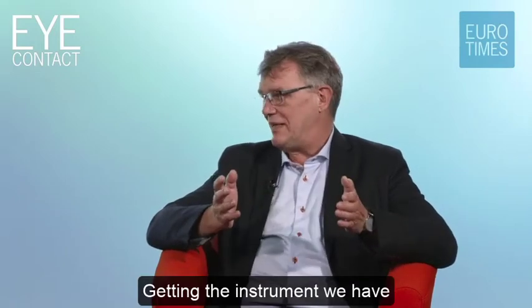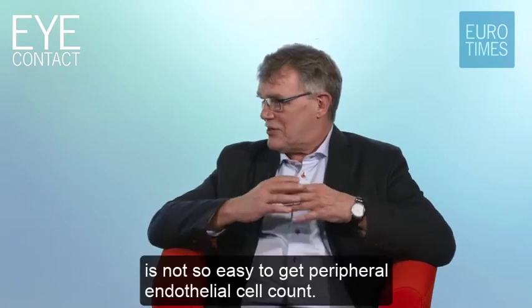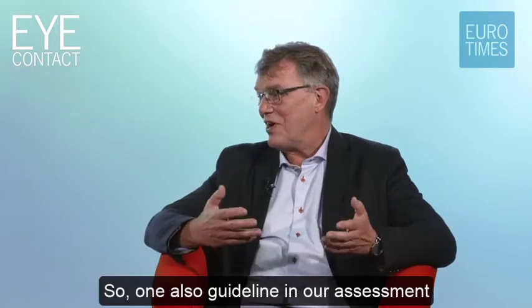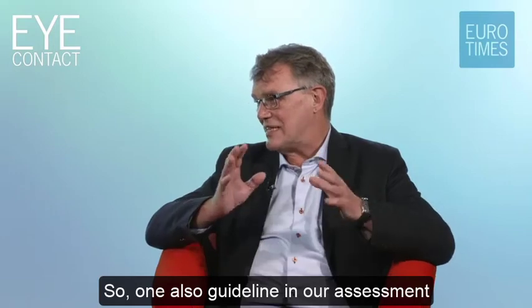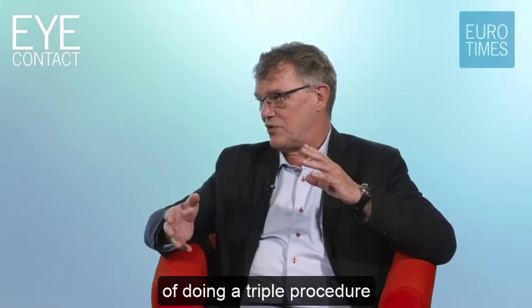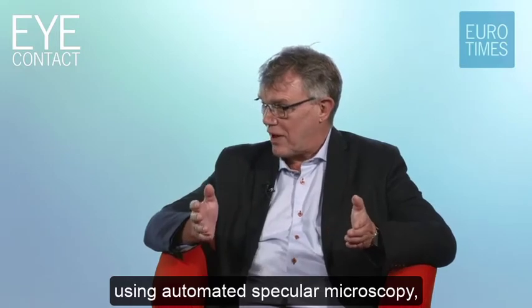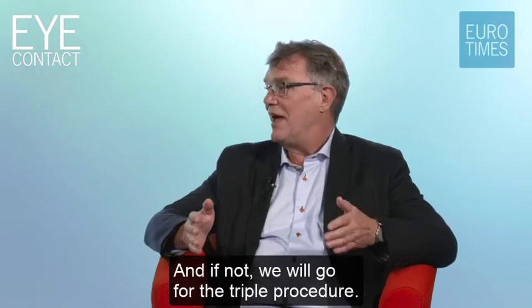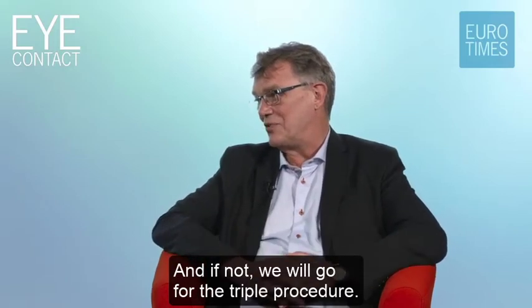With the specular microscope we have, it's not so easy to get peripheral endothelial cell count. So one guideline in our assessment doing a triple procedure or not would be, using automated specular microscopy, can you actually see some endothelial cells? And if not, we will go for the triple procedure.